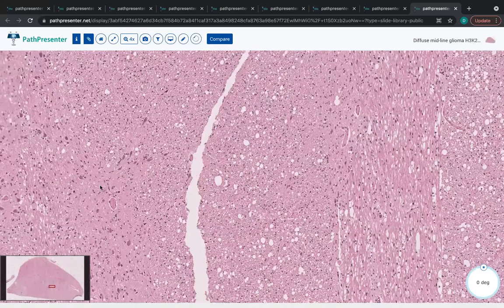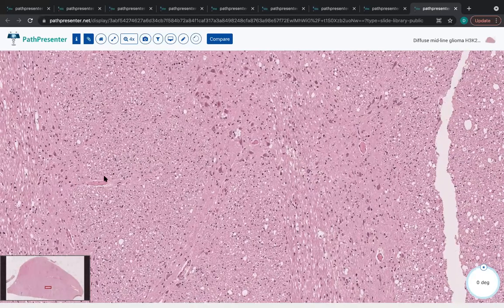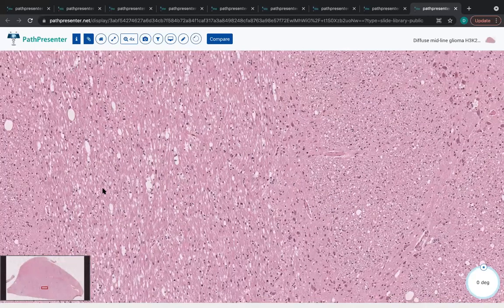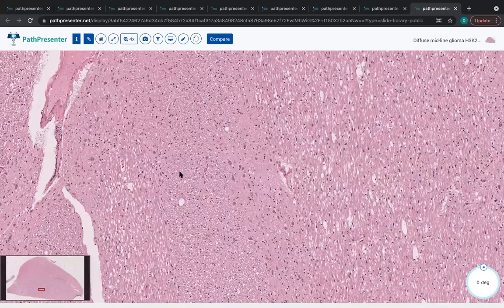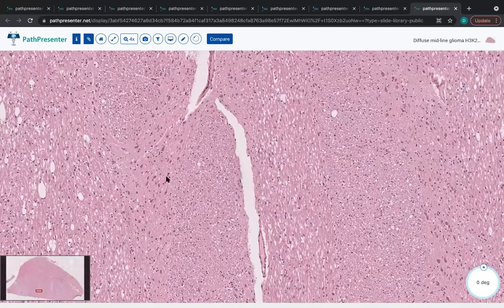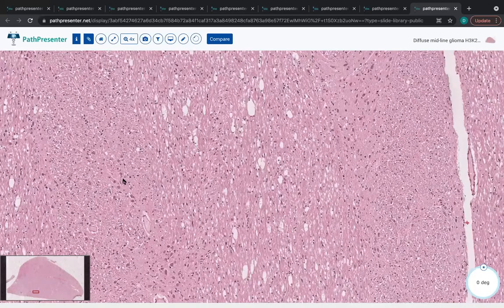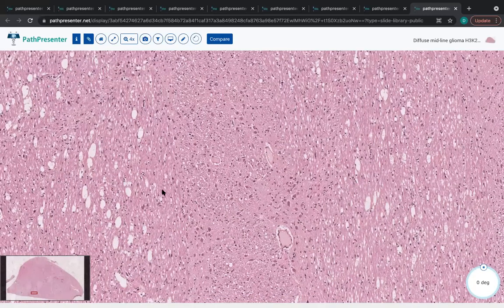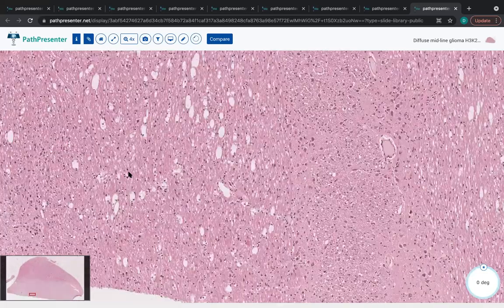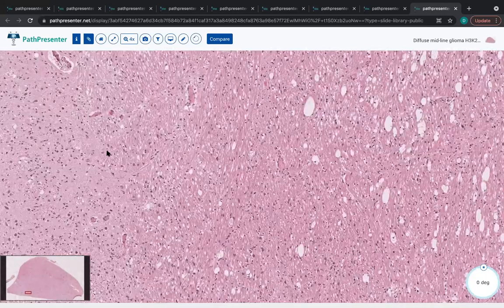So if one is encountering a brainstem or spinal cord glioma and your laboratory has that mutation-specific antibody, this is a useful tool to employ. Alternatively, sequencing studies would be highly useful for these tumors. As a result of this mutation, the trimethylation antibody for the same residue, the K27 trimethylation antibody, can also be used as a surrogate marker, and that will show loss of expression in tumor cells if your laboratory, by contrast, has that antibody.